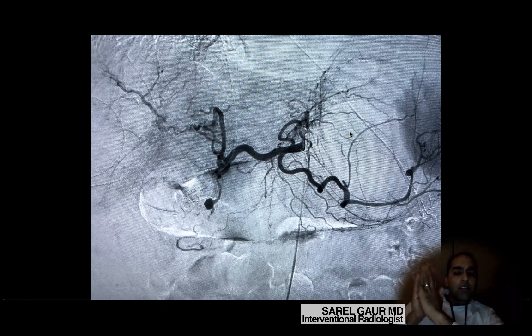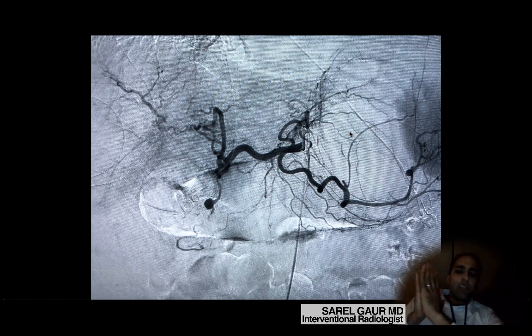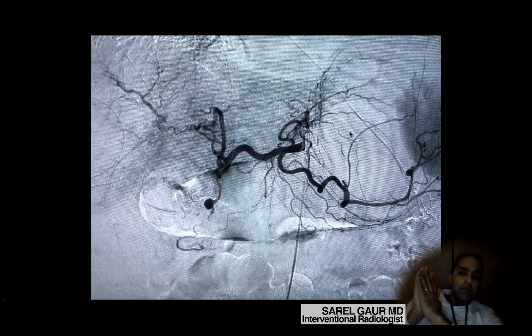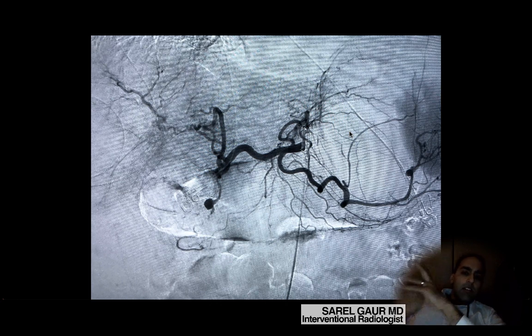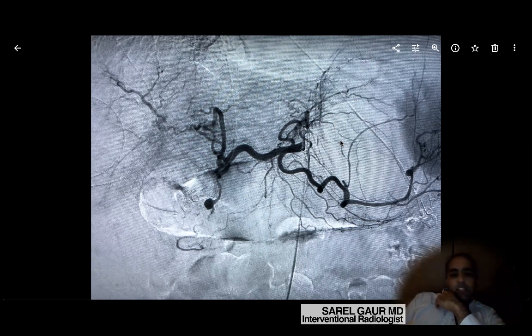We were a little bit at odds — I was more thinking to do the case, he was more thinking it's probably not worth being done. Probably because I'm younger and more excited about angiography, I pushed to have the case done. So we got the patient stabilized, got him on the table, stuck the right groin, and got a soft reverse curve catheter up into the celiac artery.